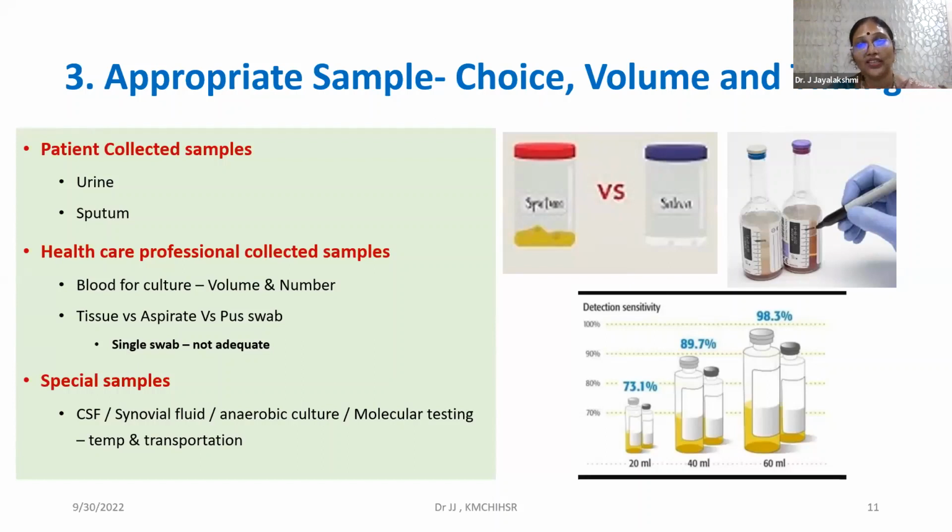So many times you will have only saliva coming in the samples that are being sent to you. This is something that worries us, because you are putting all your efforts, all your culture media, and everything is going to waste because you are processing an inappropriate sample.